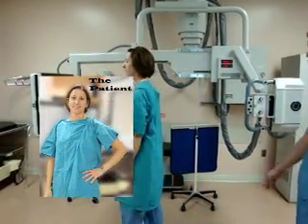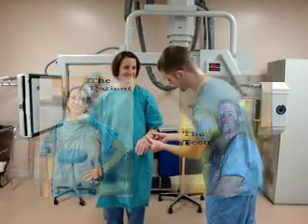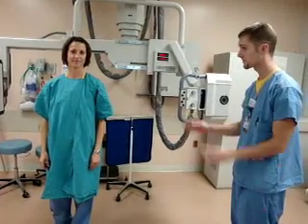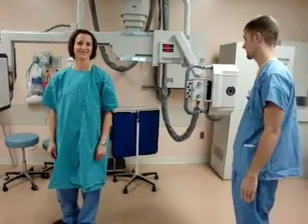Here comes our patient and our x-ray tech Eric. He will first ask the name and the birth date to make sure we have the correct patient, and if it is a woman of reproductive age we will ask if they could be pregnant or not.